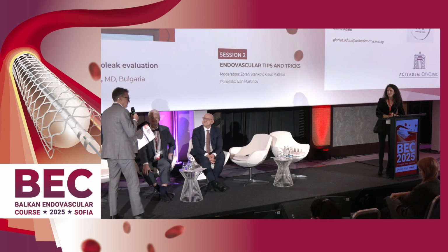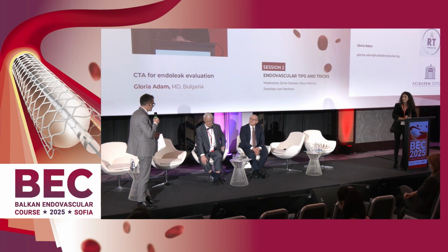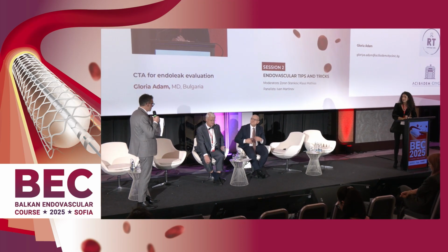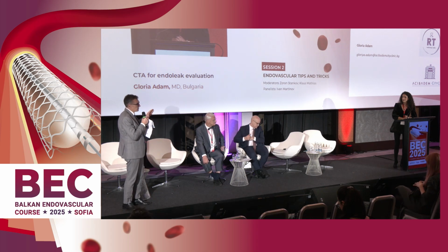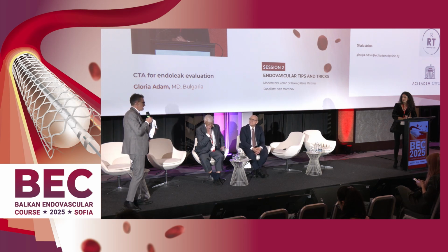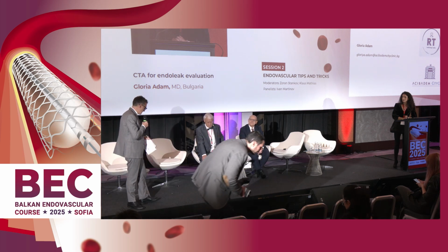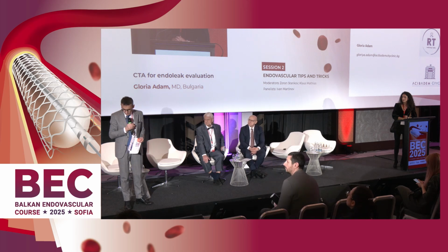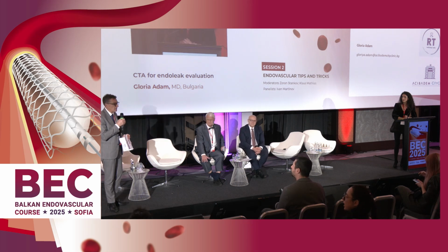Congratulations. In fact, what Gloria is showing is how important is the surveillance. So probably in several minutes, as a live case, Dr. Stankov will show you one of such a deconnection of the modules of the stent grafts. And it is, in fact, in patient, a medical doctor, who didn't make surveillance imaging for 5 years. And nowadays he has, and Dr. Janevska will show, it's probably a good idea to show the case, yeah, in order you to be aware about.